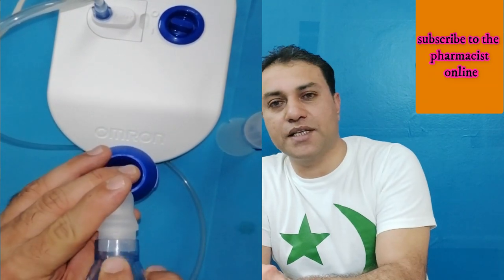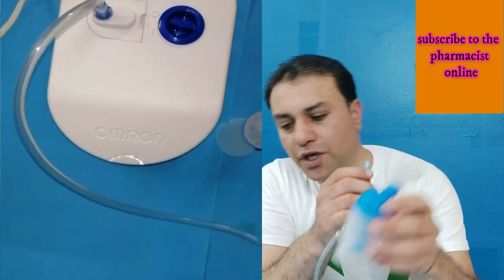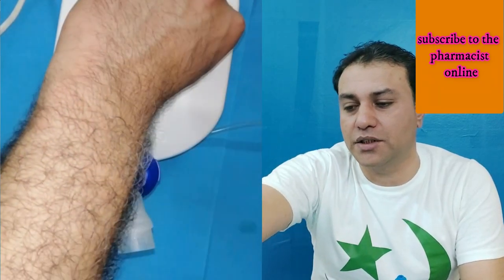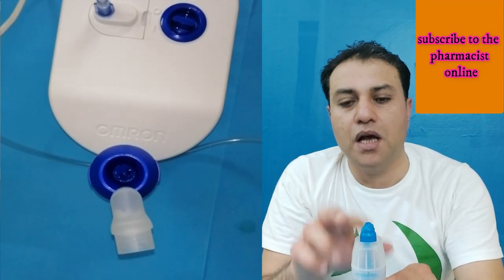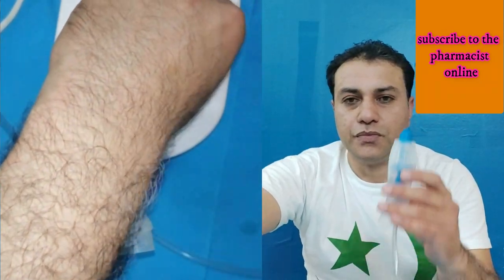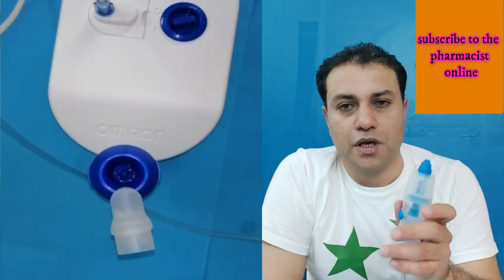Now I will show you how to use the nasal irrigation. The nasal irrigation is different from the others. You have to remove the medication container from the tube and connect the nasal irrigation nozzle directly to the tube. Turn on the device — the vapors come through the nozzle. Put this nozzle into one nostril and then the other, one at a time, for nasal cleaning.